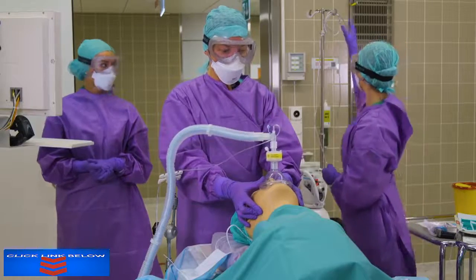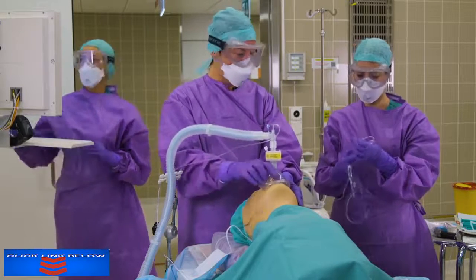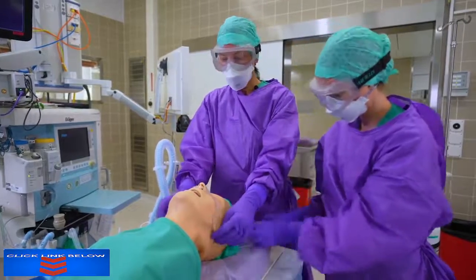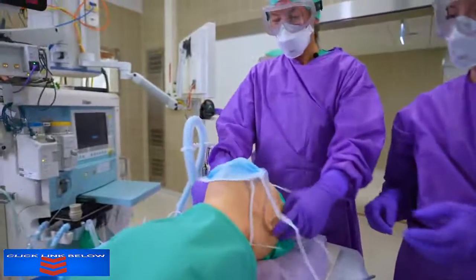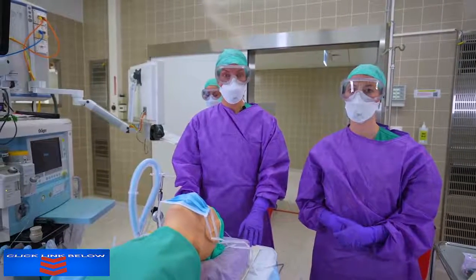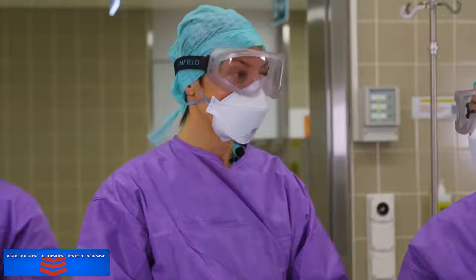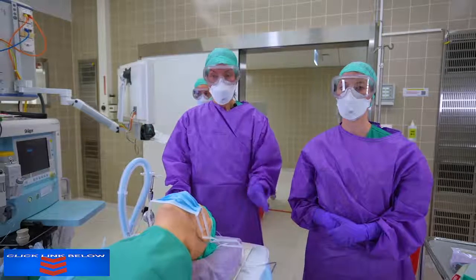Once the patient is adequately breathing, we are utilizing nasal prongs for transport. After the nasal prongs are on, the patient will also receive a surgical face mask. After successful extubation, it's important to doff your personal protective equipment according to your local standard operational procedures. Again, a body check is important. We also recommend debriefings after intubation and extubation to further optimize your procedure.